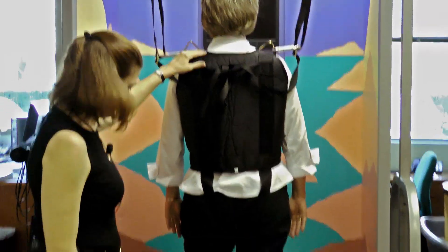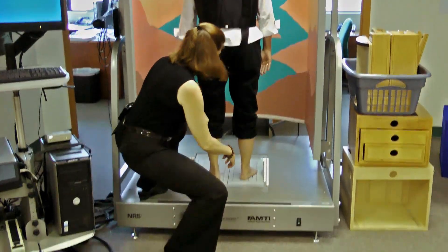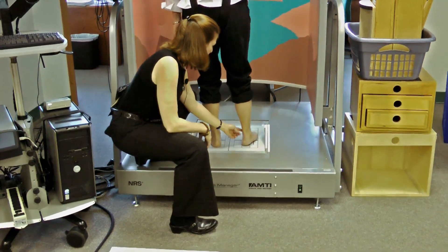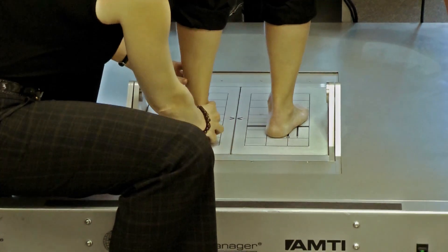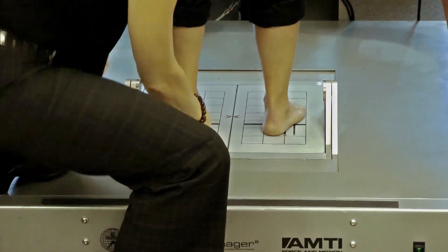Now we need to position her feet. Mary, I'm going to have you put this ankle bone here on that wide black line. And this one too, all the way up on the black line.